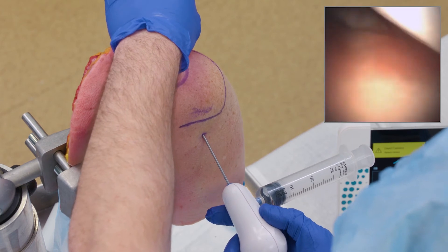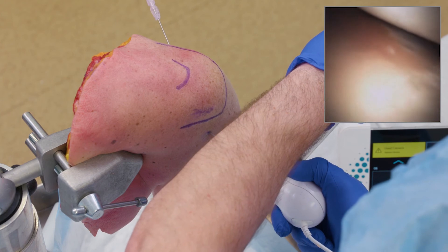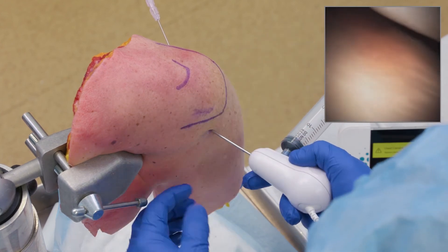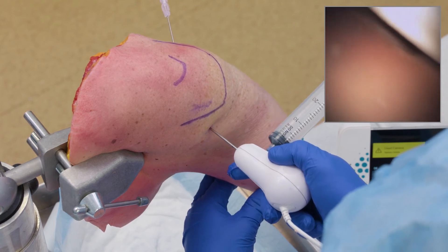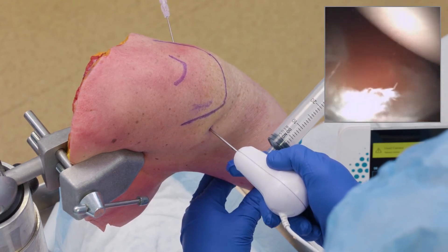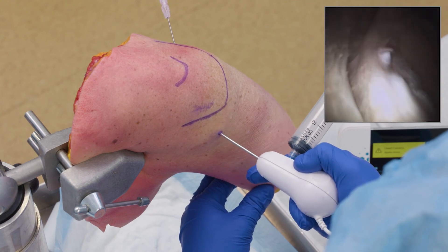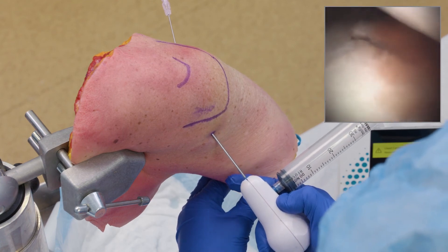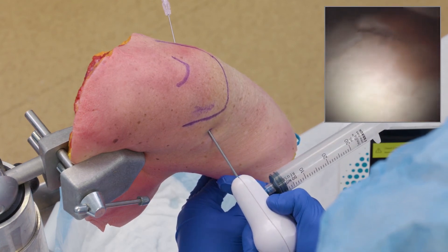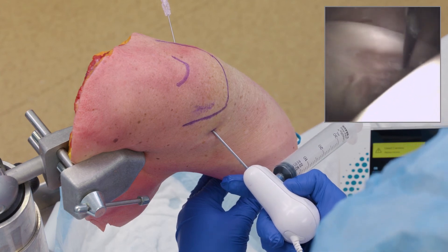I come back down — there's my biceps tendon attaching to my superior portion of my glenoid, and I can palpate that using my 18-gauge needle. I can evaluate my labrum, and if there's any soft tissue or fluid in the way I can blast that out with a little flush. To look at my Bankart region, I extend the arm out 15 degrees and look down low at my labrum. I can pull back and look at my posterior labrum, come back up the back of the glenoid, and see where it attaches back to my biceps — all with the patient sitting up but my brain functioning in a lateral position.